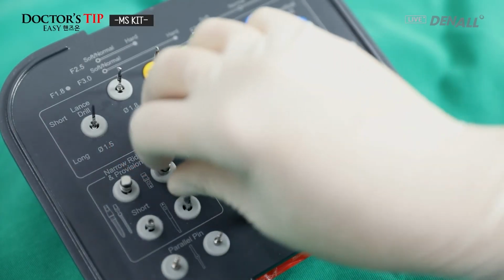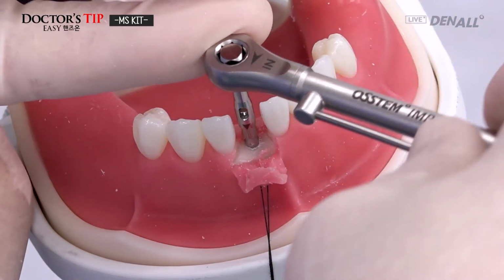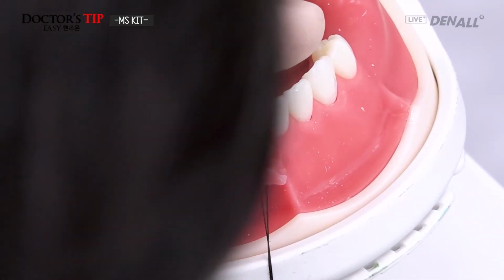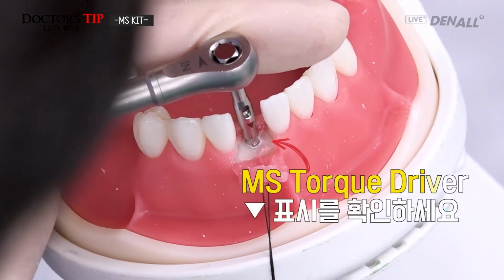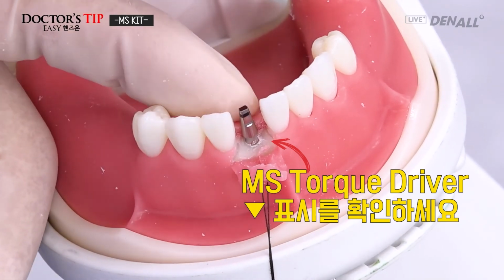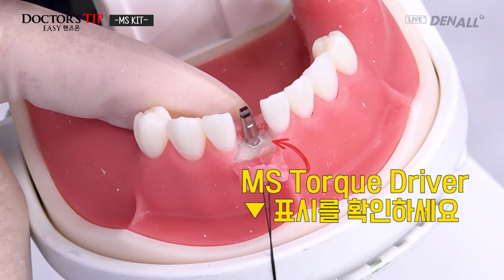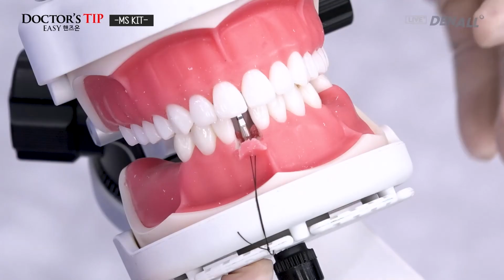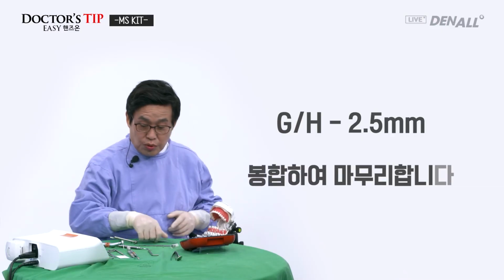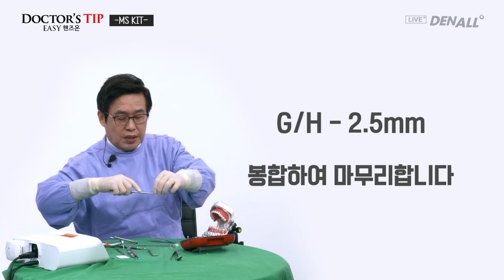And then I use this torque wrench. And you do the placement. Final positioning. Again, this triangle exists on the torque driver, so the position of the final prosthesis can be checked. And let's see whether it's aligned. Gingiva height is 2.5 millimeters, and I'll do suturing. Very simple suturing.